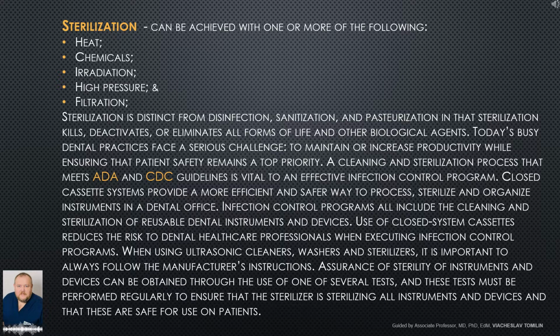A cleaning and sterilization process that meets ADA and CDC guidelines is vital to an effective infection control program. Streamlining of this process requires an understanding of proper methods, materials, and devices. Many methods of instrument reprocessing are available. Use of a complete system that encompasses and fulfills all elements that are critical maximizes efficiency and minimizes risks.